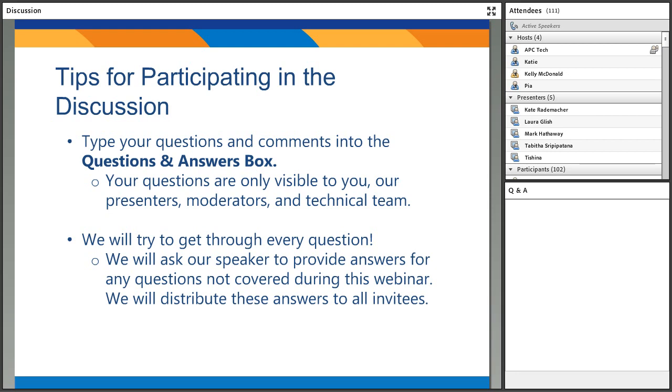So I'm going to assume IUD kits here are referring to the full package of commodity or consumables plus IUDs. In some countries, we have seen packaging together the consumables with the IUD can help eliminate some of those barriers of having the product but not having the consumables in place. It can be challenging because the products have different shelf life, so the expiration date of a packaged kit is often different than each individual component.